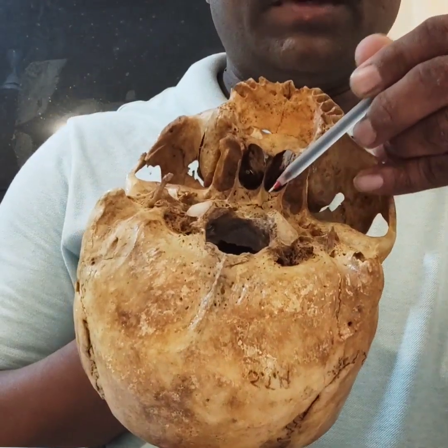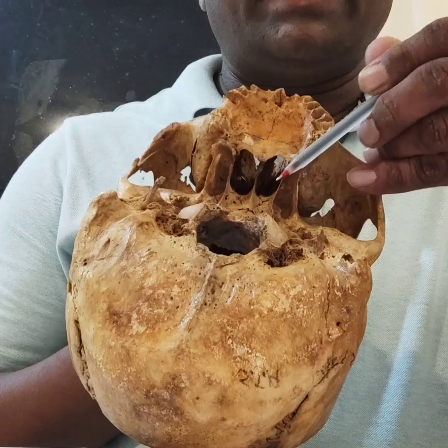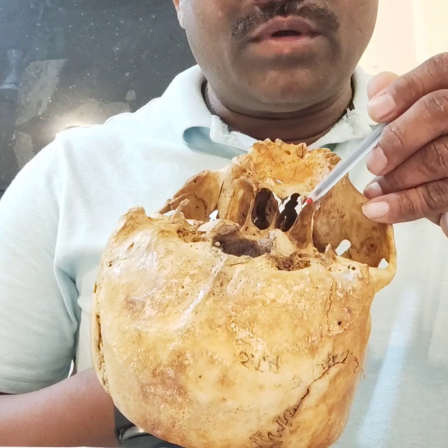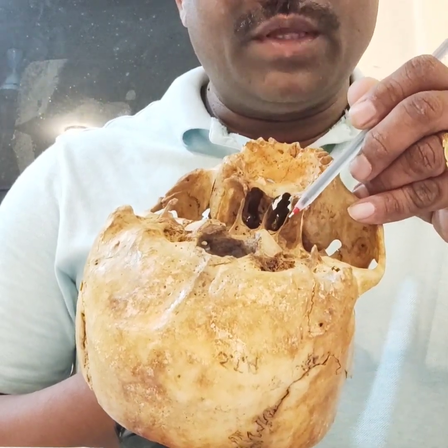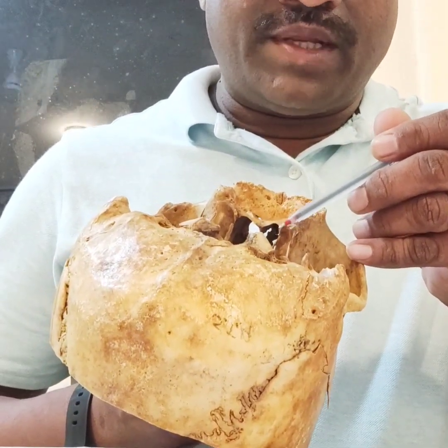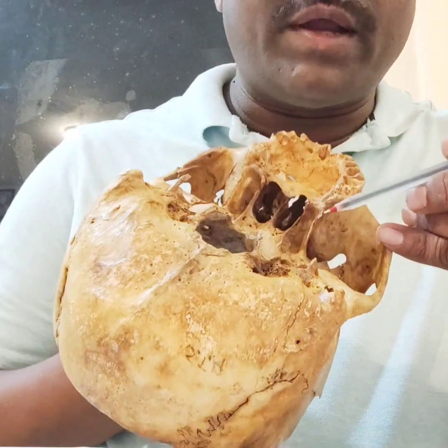It has to be this way, medially. It's almost in angulation with the hamular notch. That is the column of bone where the hamular notch passes. Through that column, you have to place the implant here. The direction is towards the medial pterygoid plate, away from the lateral pterygoid. You have to be careful about the lateral pterygoid.